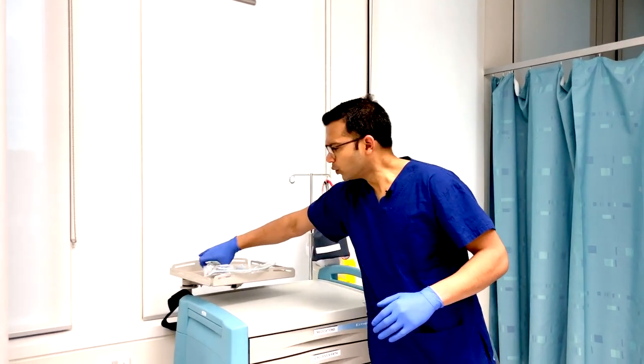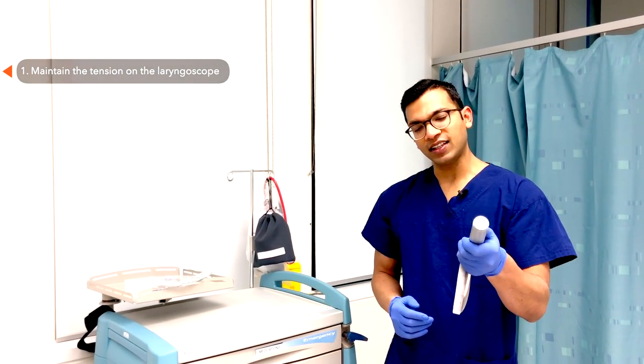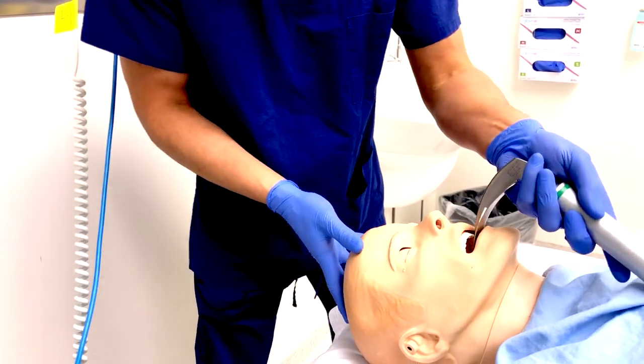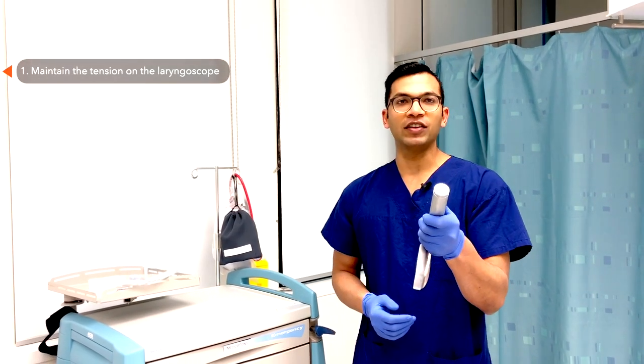First of all, it's really important to maintain the same tension on your laryngoscope, so don't ever let that tension down. You want to keep the airway as open and as good a conduit for your tube as possible, so keeping that tension on is really valuable.